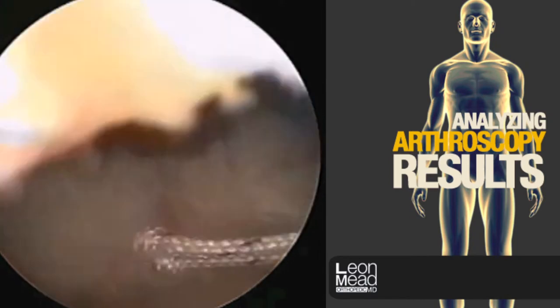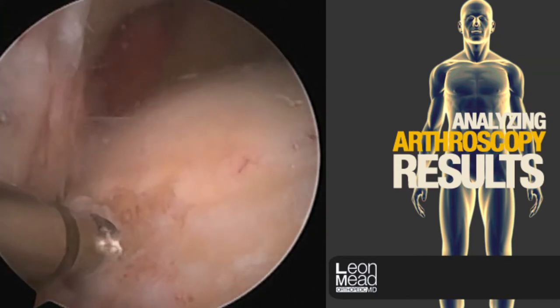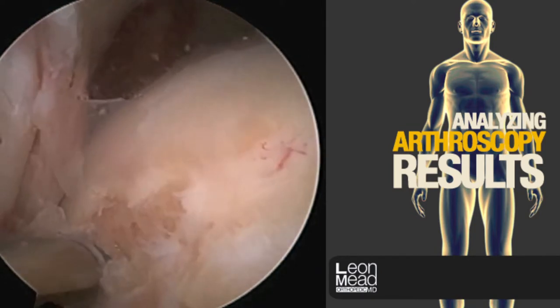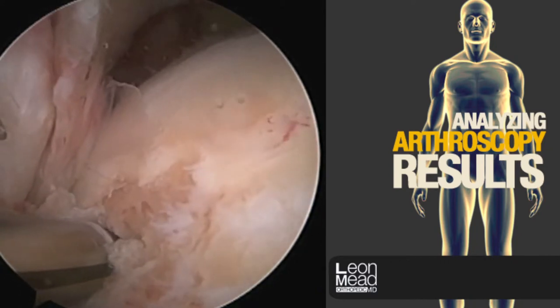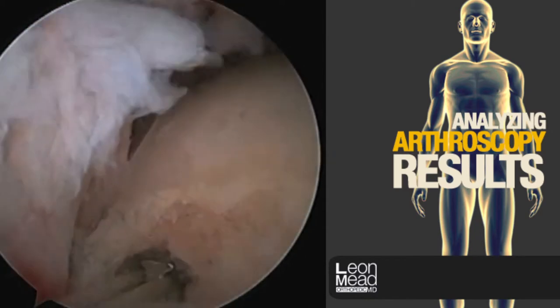The suture has been tied using the aforementioned technique and has now been cut. We're placing anchors right next to the articular surface — this is where the anatomic footprint of the rotator cuff is. We're going to use a double row repair, which biomechanically has the most stability.